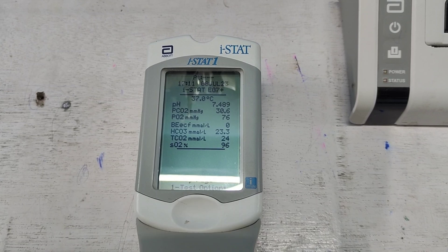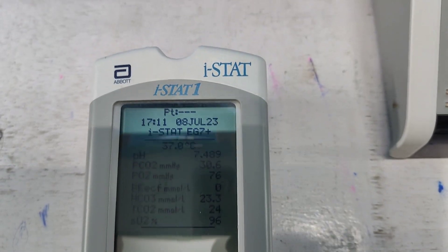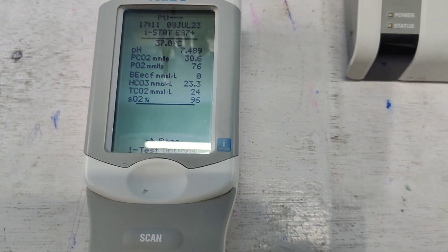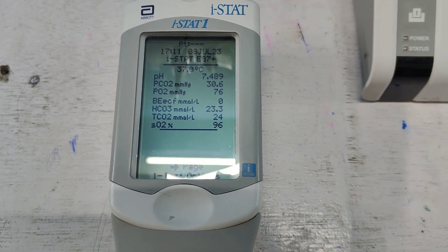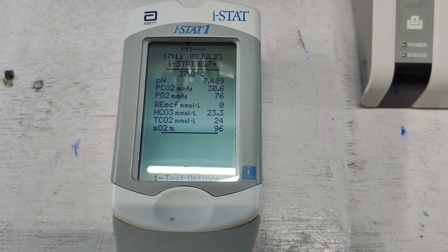Here is the result on the screen. You can see clearly: pH, pCO2, PO2, base excess, bicarbonate, total carbon dioxide, and oxygen saturation are all displayed.